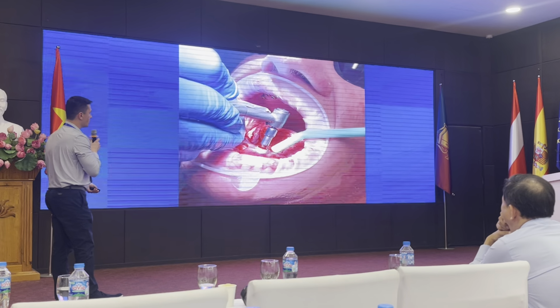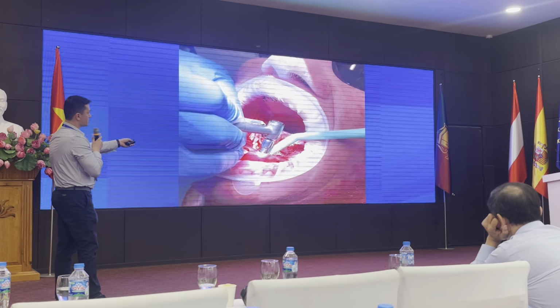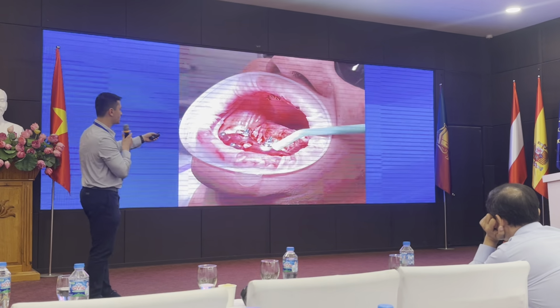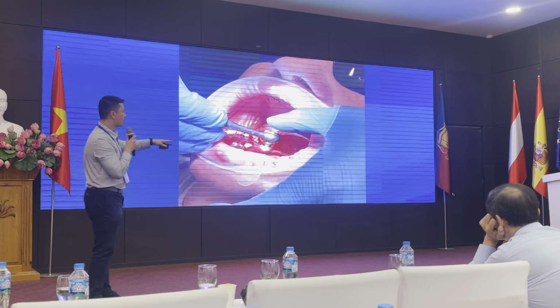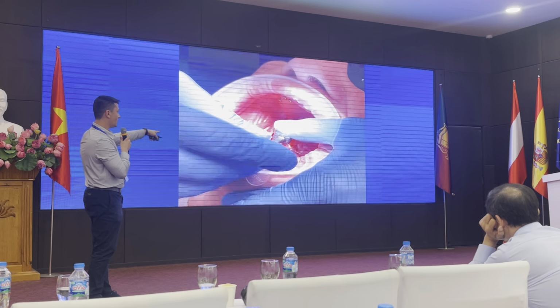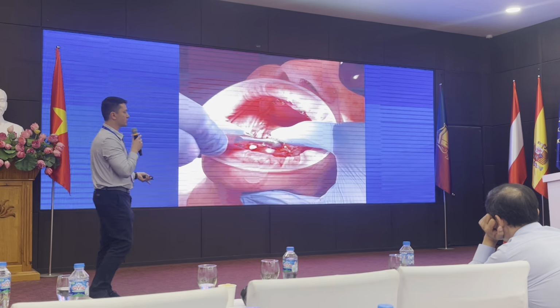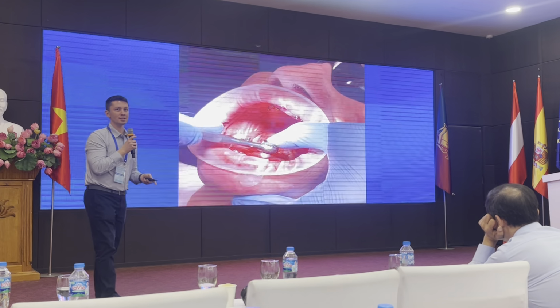Placing another implant here. The stability is so good that sometimes there's so much torque I drilled to hard bone protocol. I have to take the implant out and drill more, so that this implant can go all the way in, because I'm getting at least 60 newtons of torque on each implant. Very, very strong. That's how aggressive the TSX implant is.